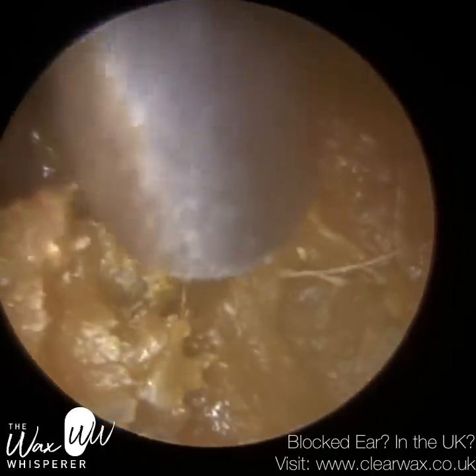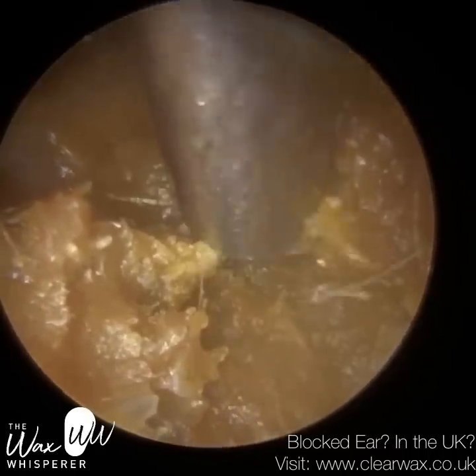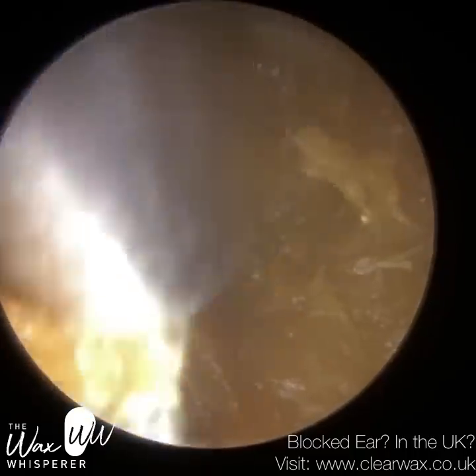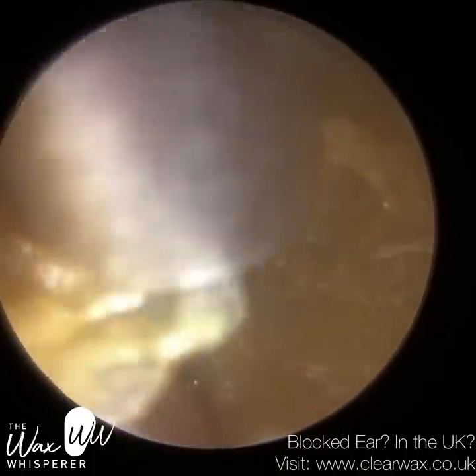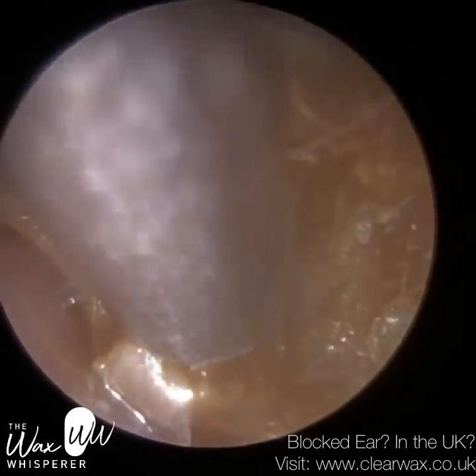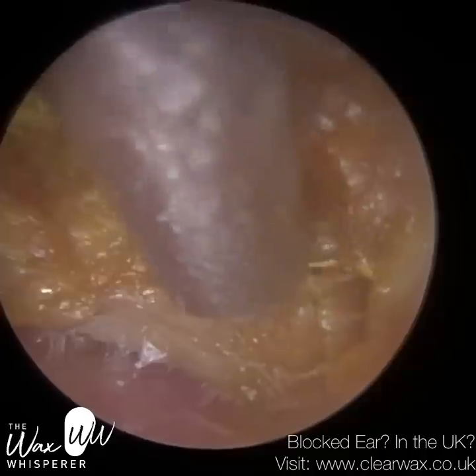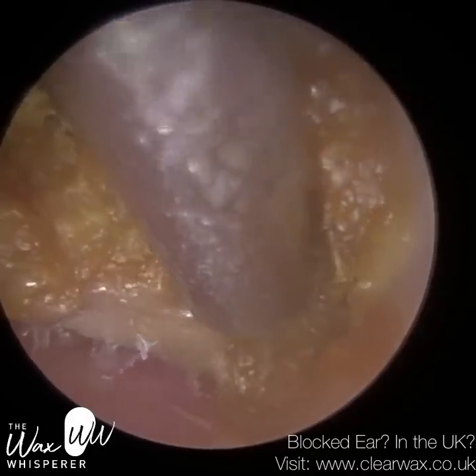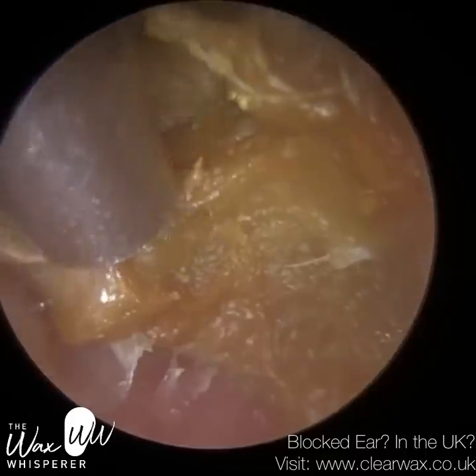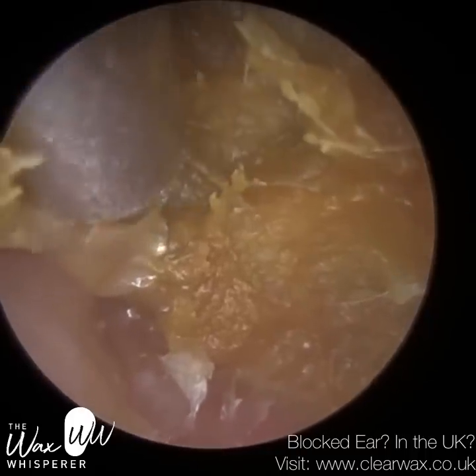I'm working at the roof of the ear canal and still can't see the eardrum, so I'm approaching with caution — we don't know how thick this final layer is. There's always a risk of over-inserting the suction probe and making direct contact with the eardrum, which would not only be very uncomfortable for the patient but could perforate the eardrum and make matters far worse.